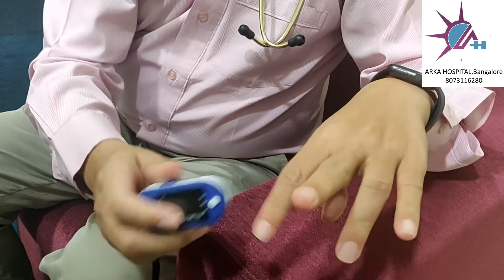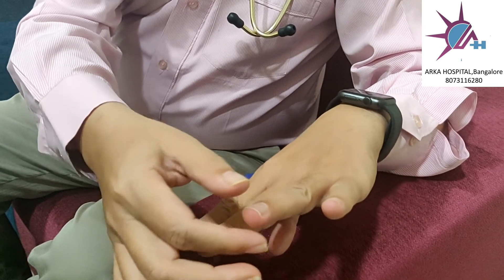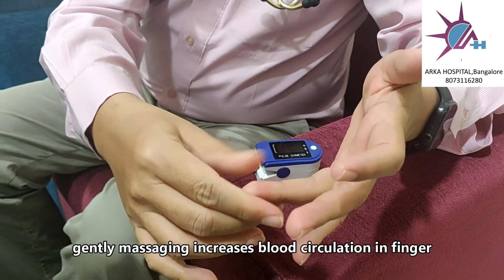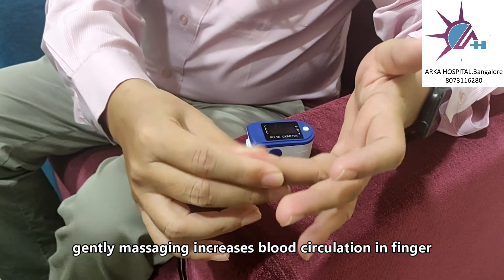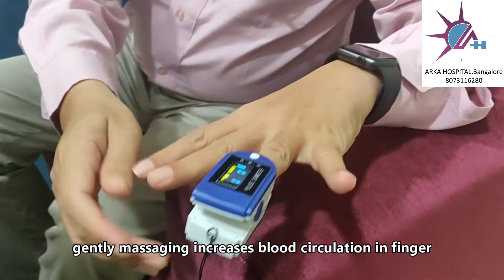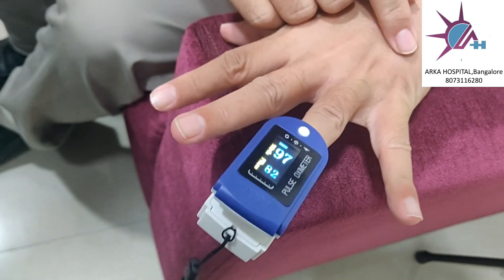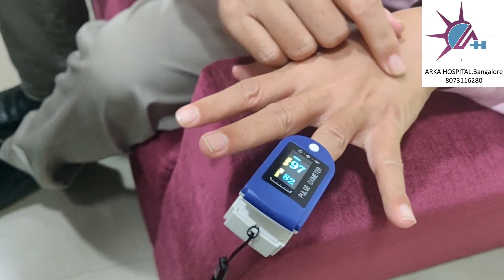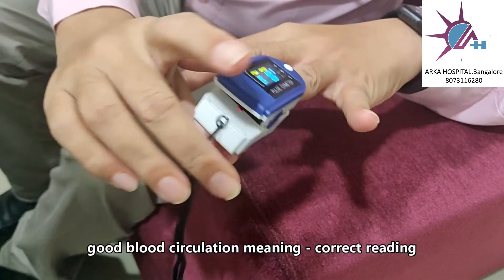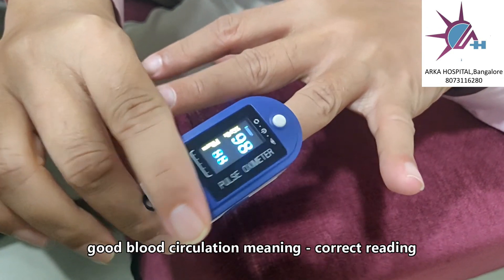Before putting the pulse oximeter on your finger, gently massage the finger. If it is cold, the reading does not come well. When you massage like this and then put the pulse oximeter on your finger, the reading will be much more accurate. Otherwise, if it is cold, blood circulation will be less and your oxygen level may come lower than what it actually is. Thank you.